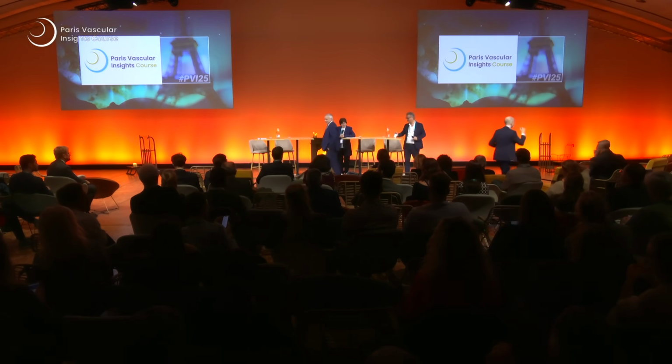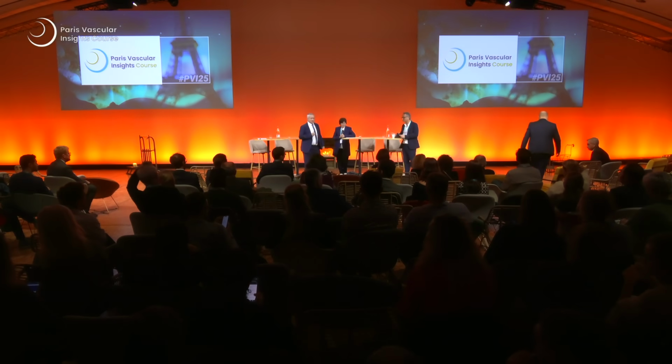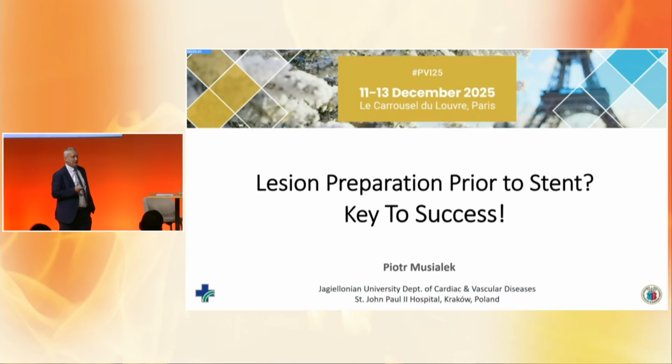It's great to be here. It's great to see so many people on the morning of the first day only. So it would have been a transfemoral case for us, I have to say, the previous one. We would have tried transfemoral, and there's ways you can do it with experience. Nacho mentioned things like extra stiff wire, for instance, in the external carotid. This gives us more room for the devices.